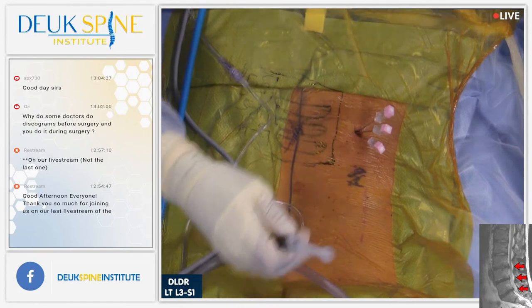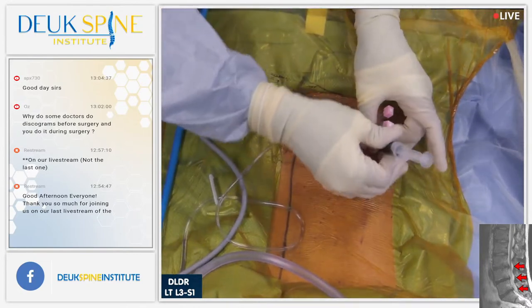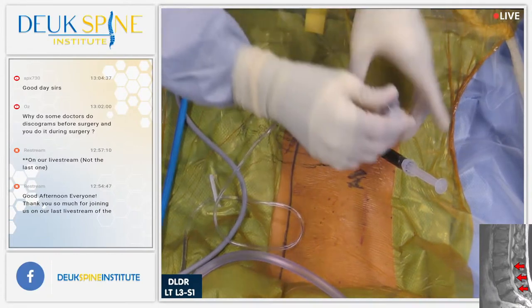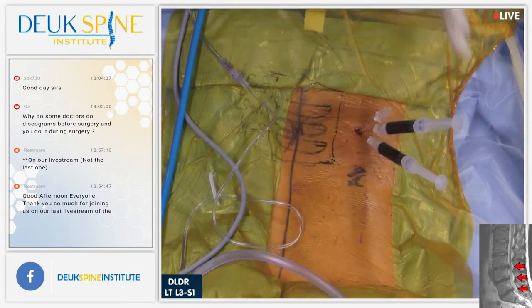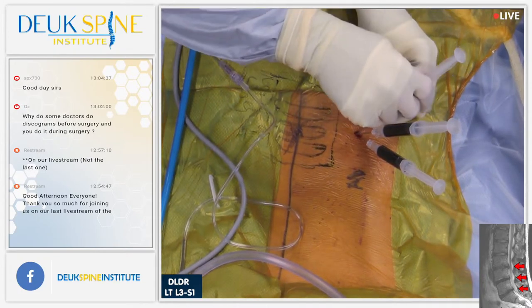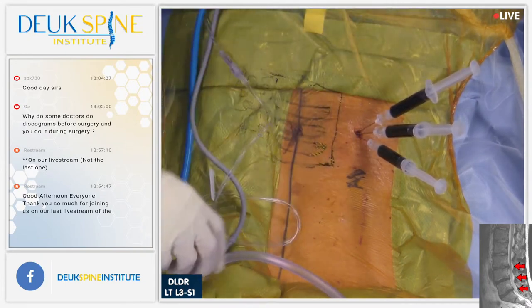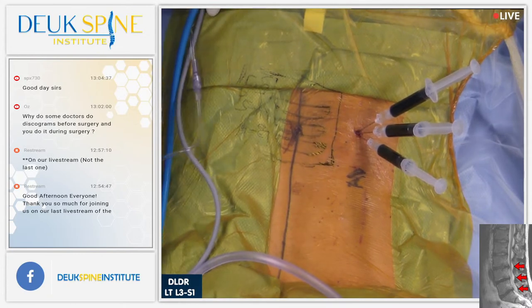So the two parts of the surgery that need patients to be awake. Number one, when I'm passing through the foramen near the nerve root, I want them awake so they can tell me if I'm too close. And number two, I don't know what happened, guys, but we're showing a lot of white behind, like air, which we shouldn't be. Jordan, I shouldn't have to tell you this. You should automatically know we're switching from AP to lateral, and you need to adjust your collimator, okay?